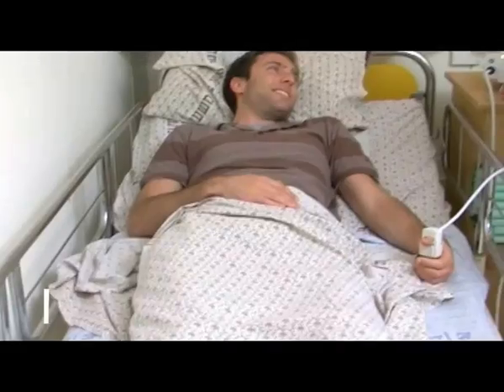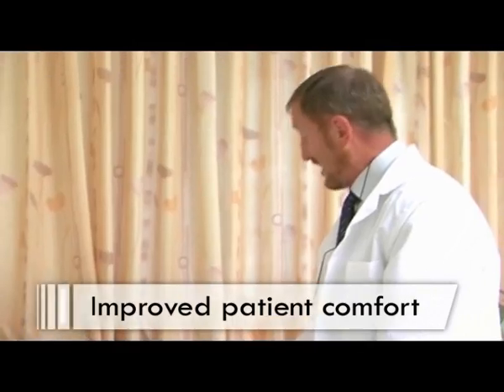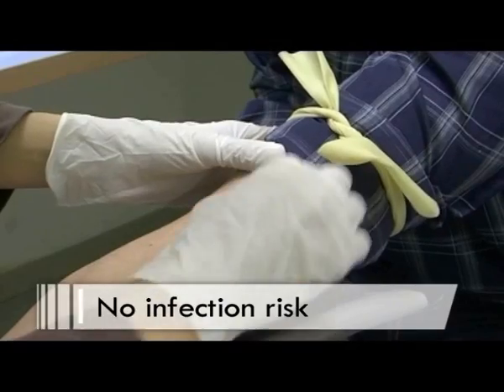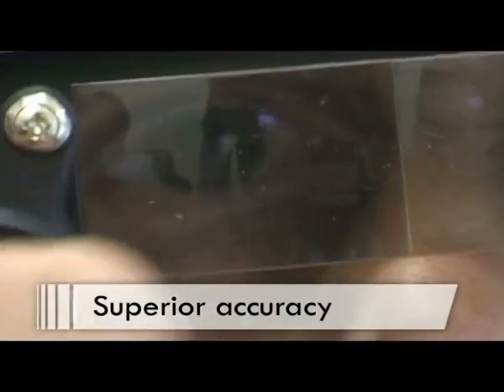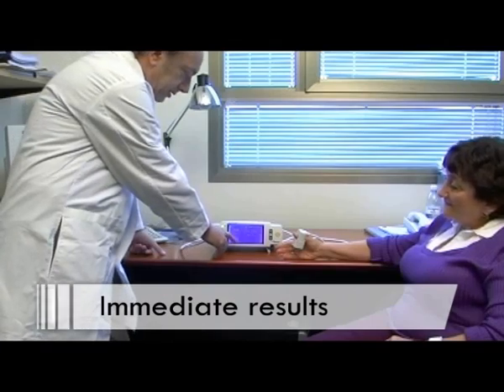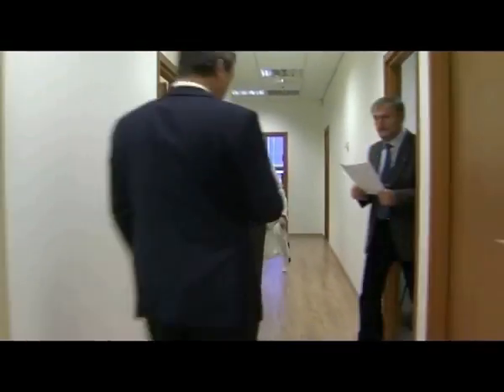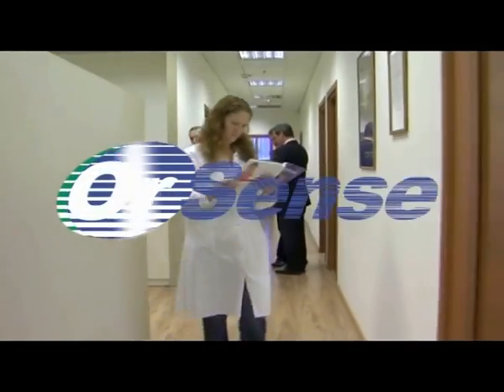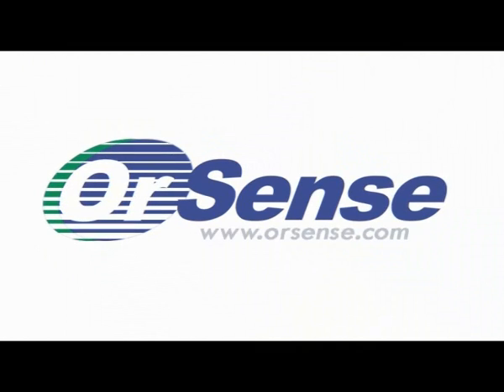MBM200 and the MBM200MP: a revolution in non-invasive blood analyte testing. Improved patient comfort. No infection risk. Superior accuracy. Immediate results. OrSense — new possibilities in blood measurements and monitoring.